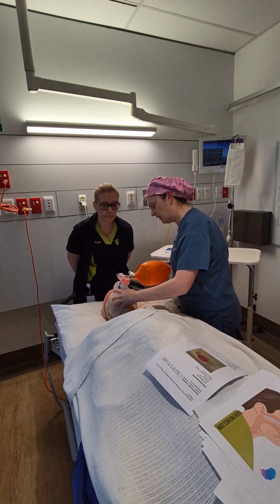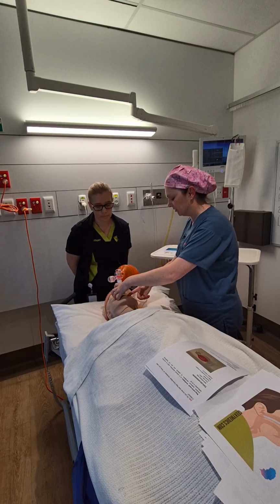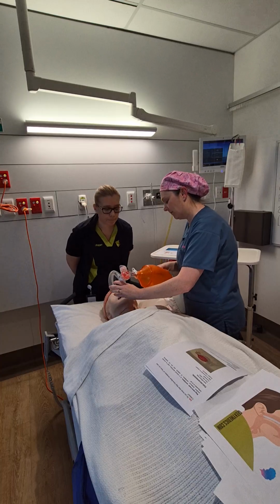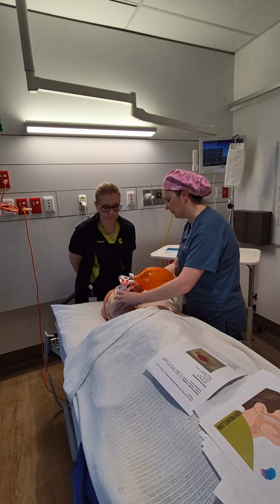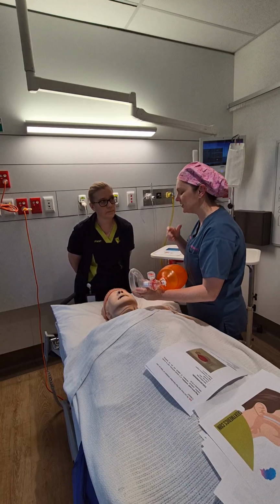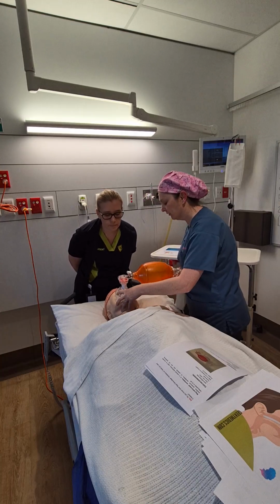Okay, so the best way to pop the mask on is to go from the bottom of the chin, and then just pop it over the nose. You don't want it too far up, otherwise you're not going to get a seal on the mouth, and you also don't want to be blowing anything into the eyes. You also don't want it too low, because then you're not going to encapsulate and get a nice seal over the nose. So I always just go to this part of your chin, the base of the mask, and then go over the nose.